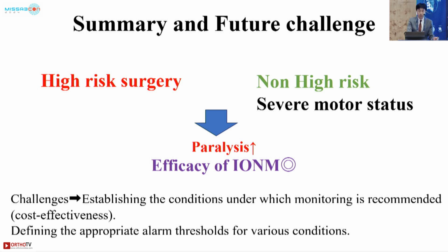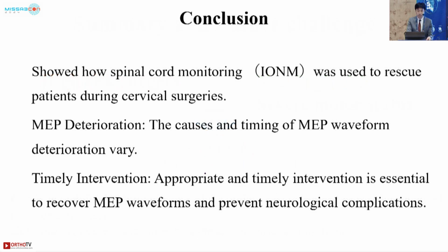Thus, it's not only a question of 70%, but also a future challenge to determine the conditions under which monitoring is recommended and to approach alarm point criteria. In conclusion, I showed how spinal cord monitoring was used to rescue patients during cervical surgery. The cause and timing of MEP waveform deterioration vary. Appropriate and timely intervention is essential to recover the MEP waveform and prevent neurological complications.